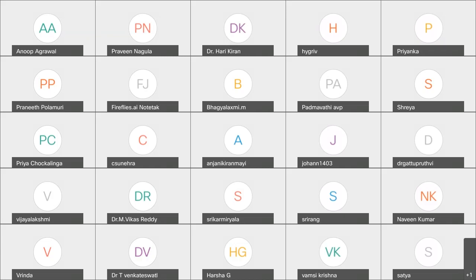Sir, seeing the Holter runs of NSVT and the cardiac MRI showing 24% of scar burden, I would go for ICD, sir. You'll go for ICD for this patient. So, yes. Okay, that is good. Anybody else has got any other thoughts about this case?